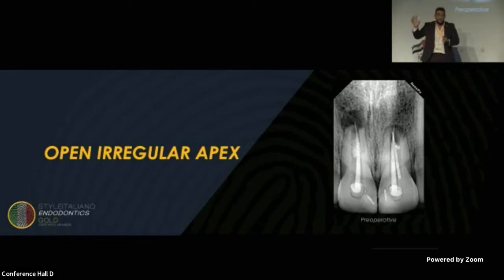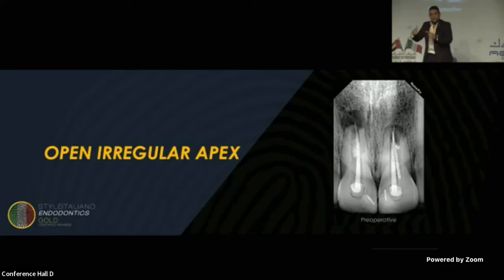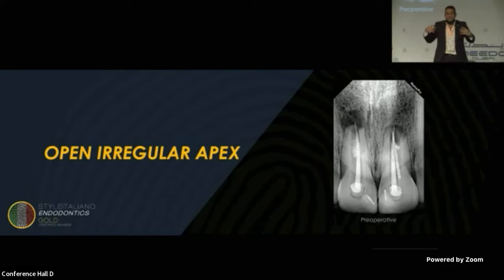If you know that you're fighting microorganisms, for sure, you will take your time trying to look for extra anatomy. You'll take your time trying to reach the full working length by passing and managing separated instruments to reach the working lengths to provide a good cleaning. You'll activate the irrigant because you understand that the anatomy is already complex. This is the main goal of our treatment.